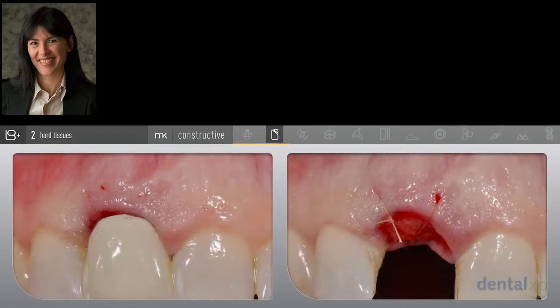I may choose to put a variety of materials underneath there, but along the way, we all have to tweak things, right? Because we realize that the subtle little things we do right or the subtle little things we do wrong can very significantly impact the outcome at the end. So this is the same case. It was really realizing whether one of my suturing techniques is appropriate in terms of what it does or does not do to tissue. So I've chosen to resuture in a correct way compared to how I started.